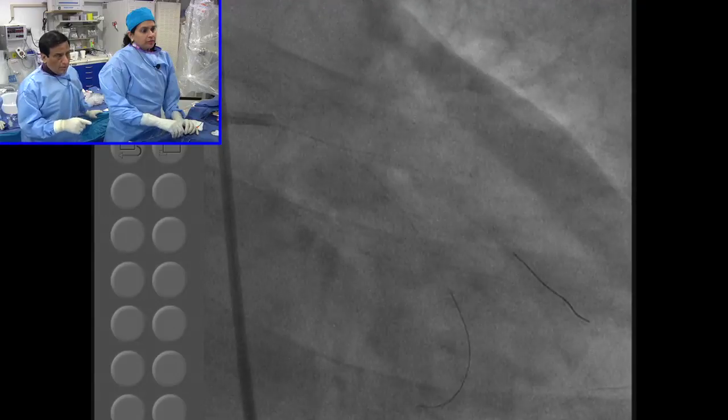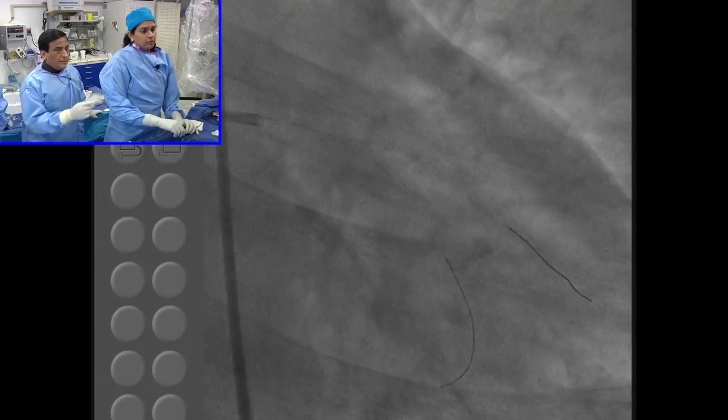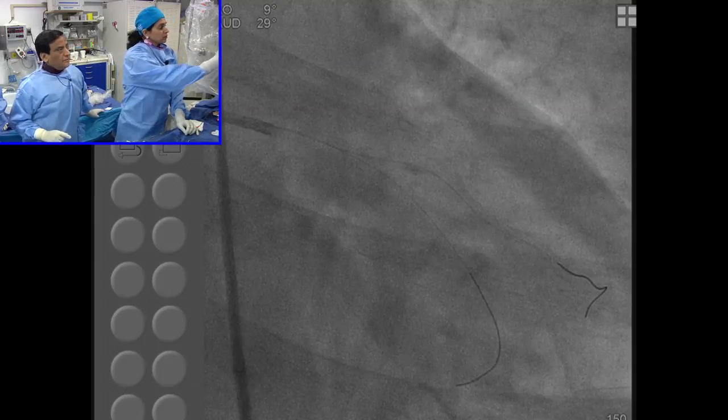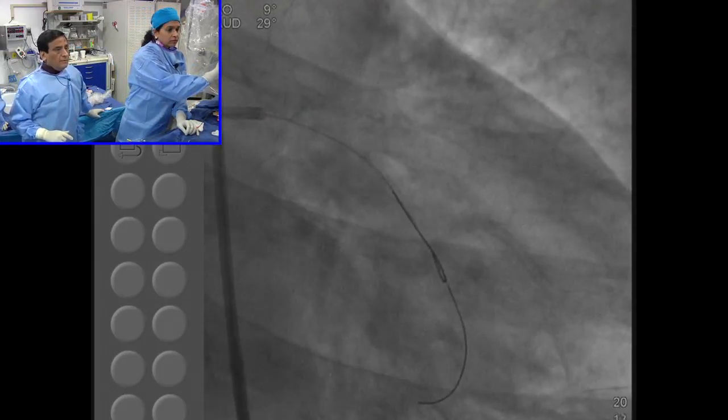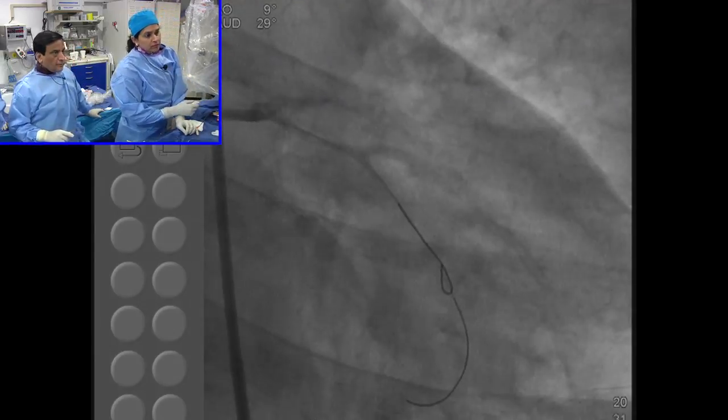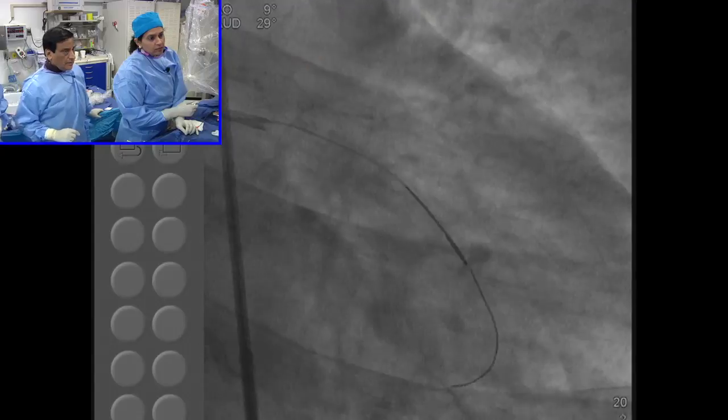And I think more importantly, look at the distal vessel of this distal circ. You need to do a balloon dilatation. See the last one, because it looks a little inflamed now. Do you want to see one more picture? You can see this now. So almost discontinued.